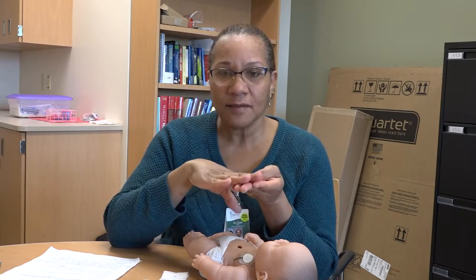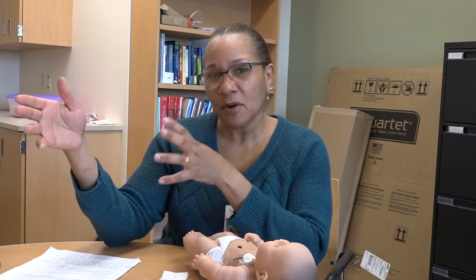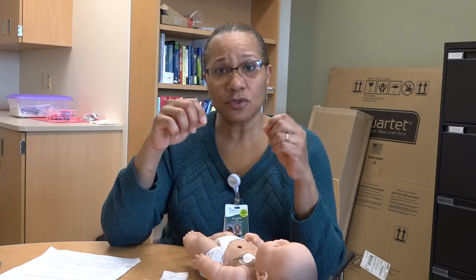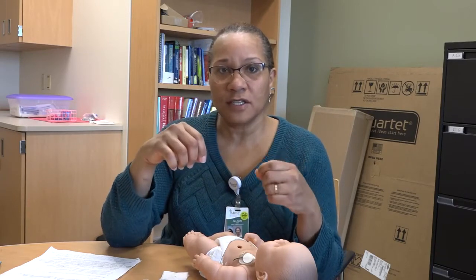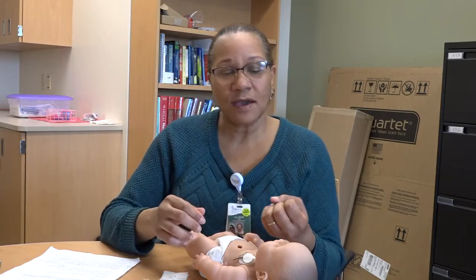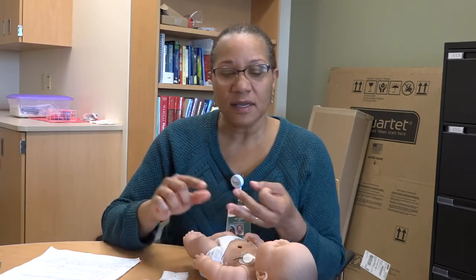But once you hit the post-operative period, about 2 weeks out or so, that area is going to start to heal and change. When you're looking at the baby's skin every day, you want to get used to what the normal look of that G-tube site is, so you can more easily identify when it is not normal. Once again, some of the ways it's looking right now post-operatively are the things we want you to pay attention to after it heals: increased redness, swelling, and tenderness to touch.